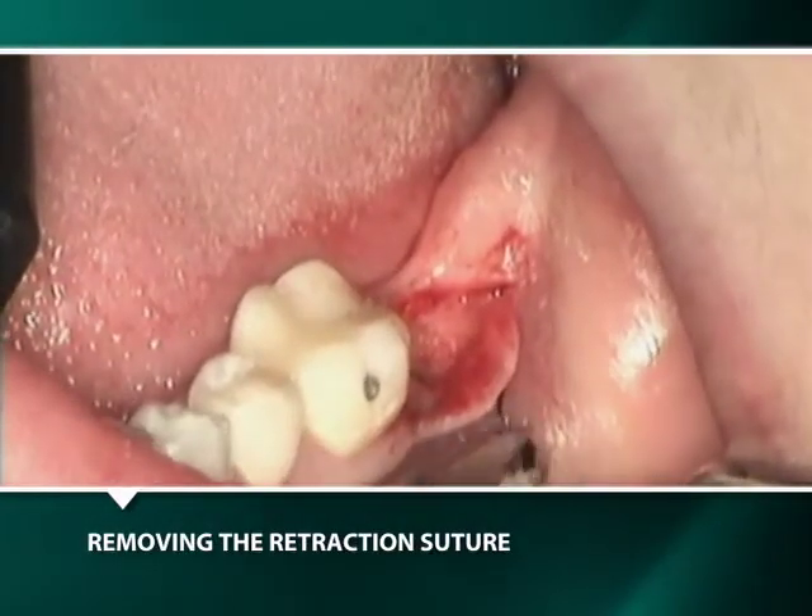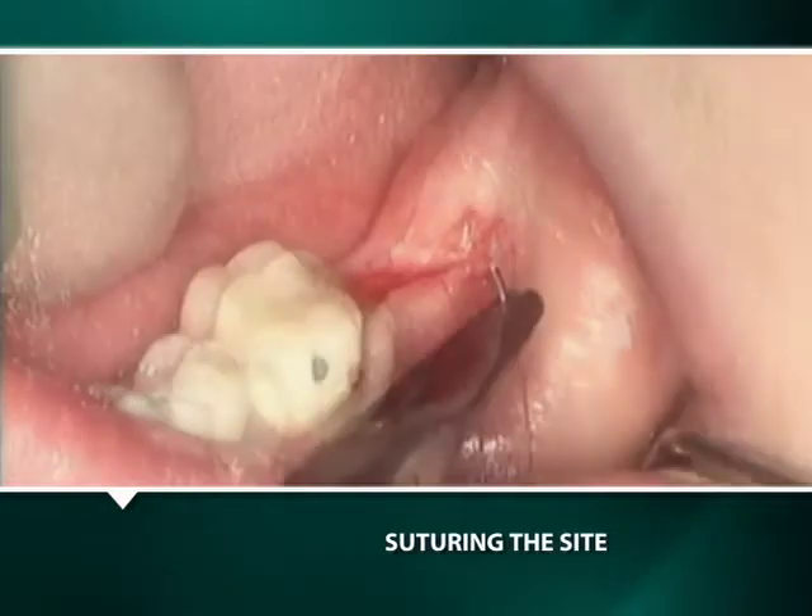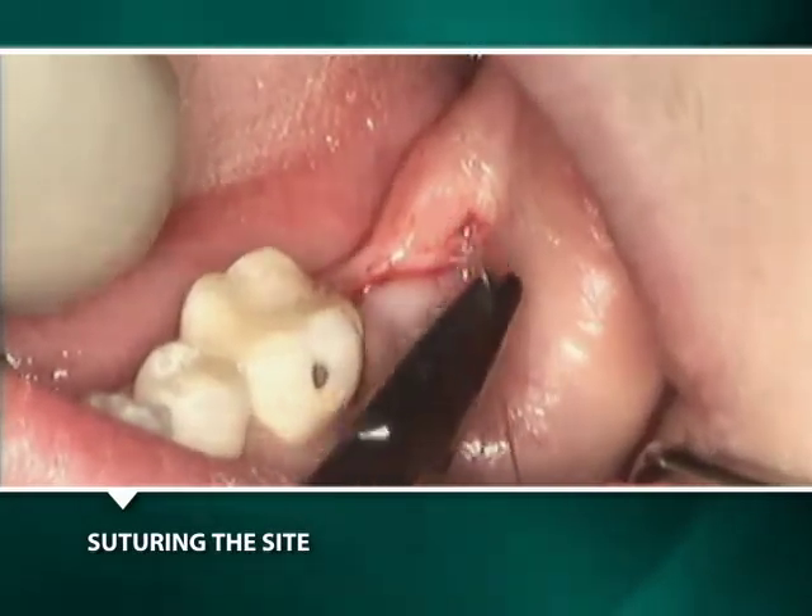The silk retraction suture is removed and a resorbable figure-of-eight suture is placed to close the flap.